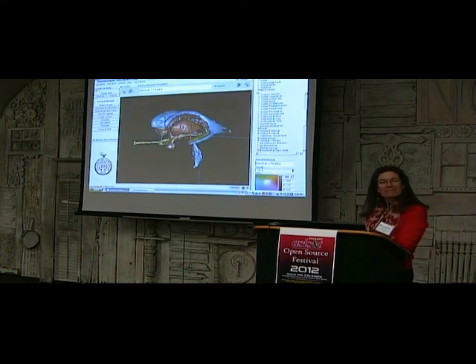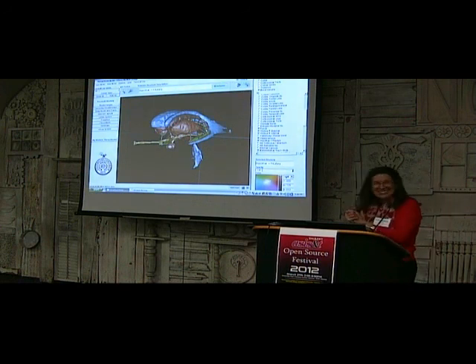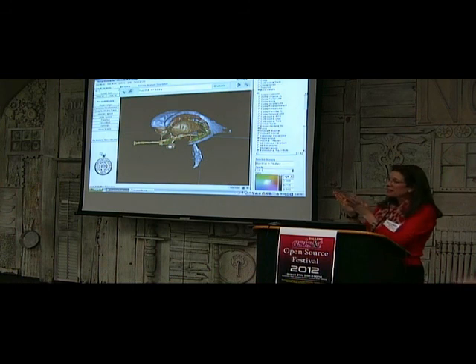Did you guys know that you'd both be here? No, until the program went out. I wish I had seen your talk yesterday because last night I was segmenting ventricles by hand. Yeah, it's a real job, but honestly, that is the reason that this kind of software had not been produced before.